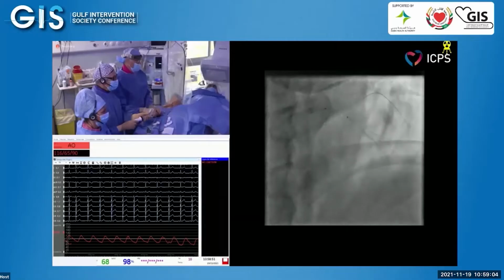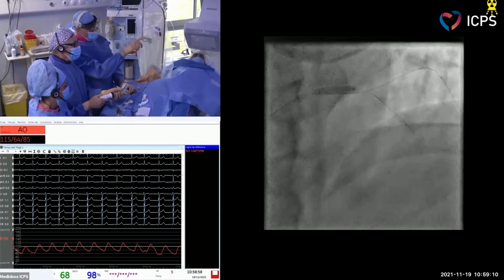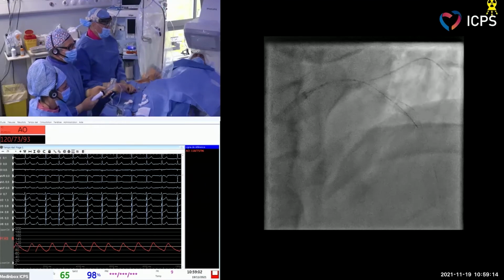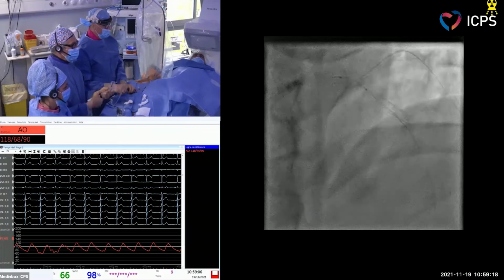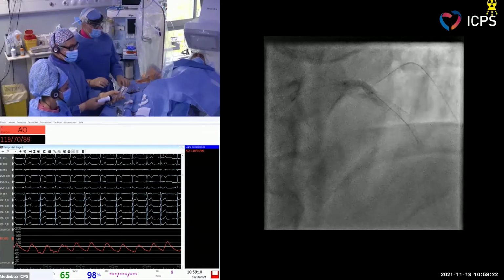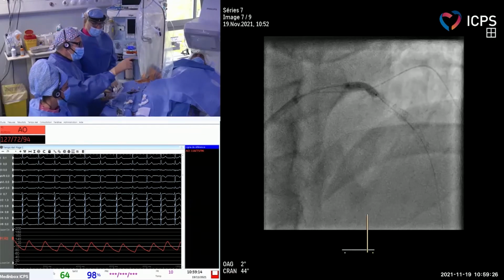Do you tend to give the whole cycles, all the cycles? Not always. It depends on the expansion of the balloon. If we have a good expansion, we'll not use every possibility. So we can go up to 80. You see there is still a waist on the balloon.